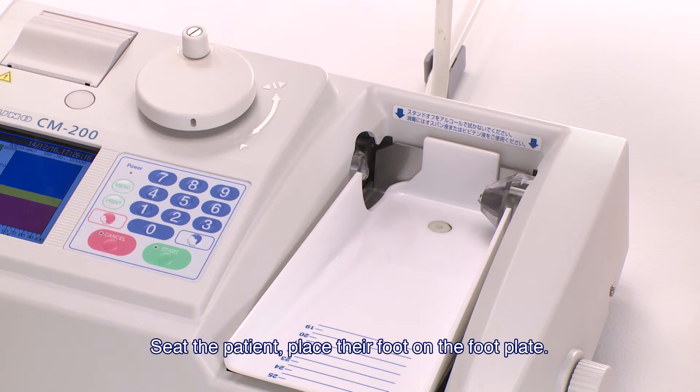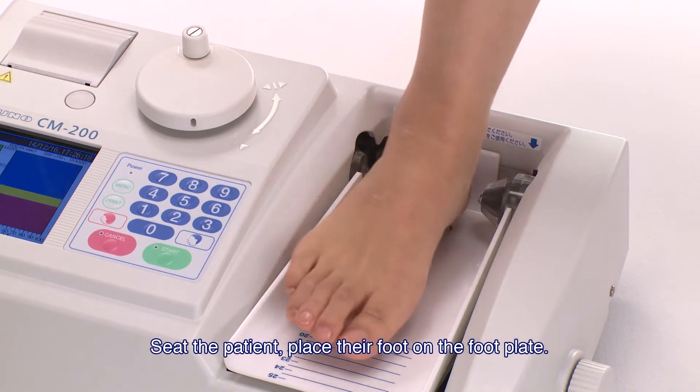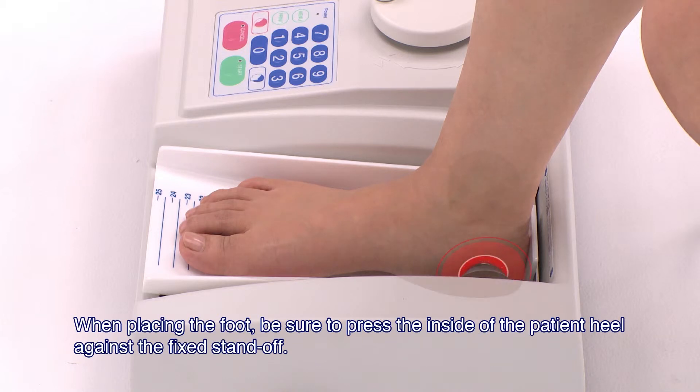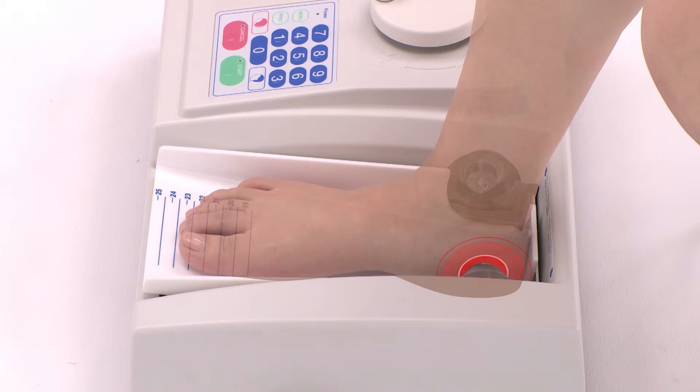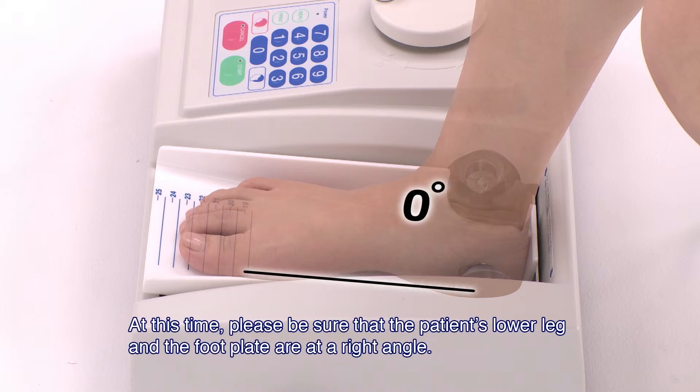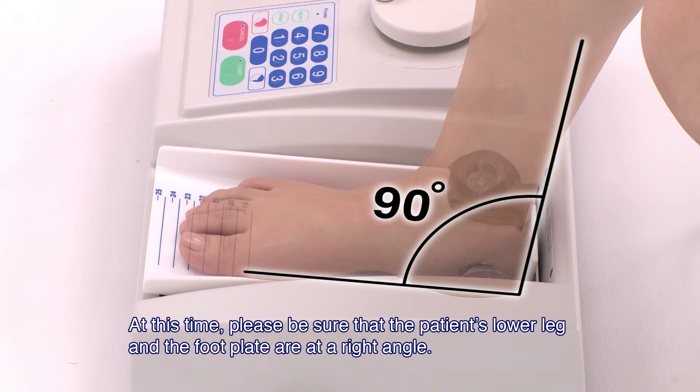Seat the patient, then place their foot on the footplate. When placing the foot, be sure to press the inside of the patient's heel against the fixed standoff. Place the foot pointing straight on the footplate. At this time, please be sure that the patient's lower leg and the footplate are at a right angle.